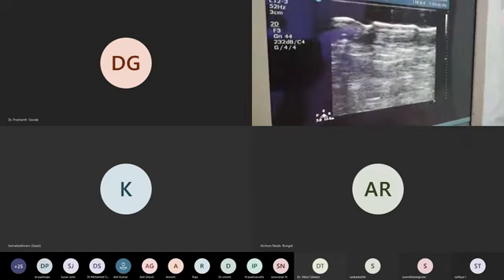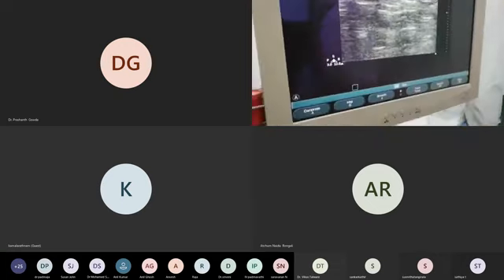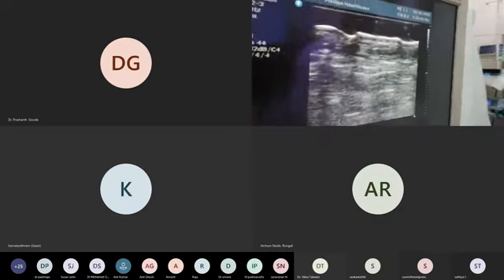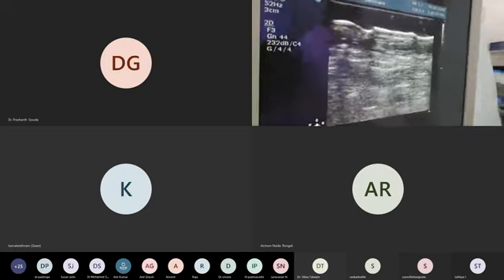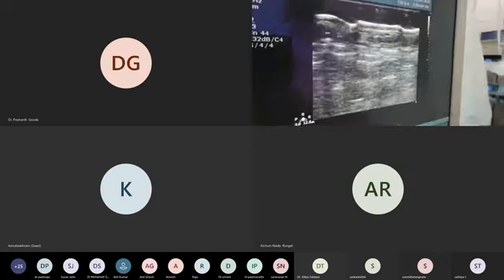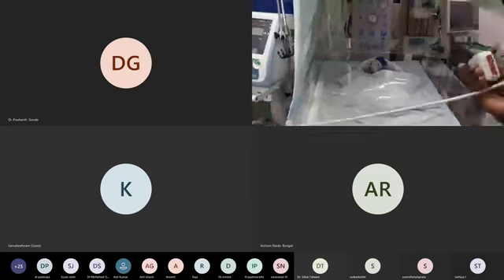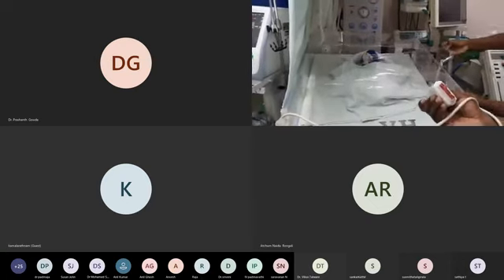Now I am going to put the baby. I have to come near the baby. Can you just remove the baby's cloth? Just come. And in my hospital, I know that incubators are very good for babies less than 1000 gram. Previously we used to have so much infection.